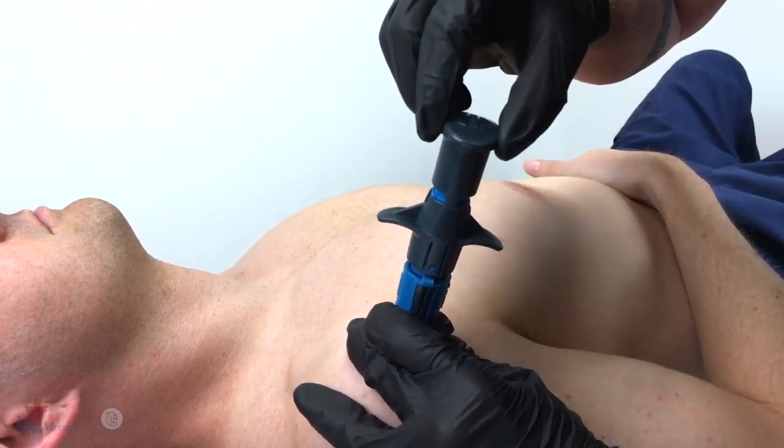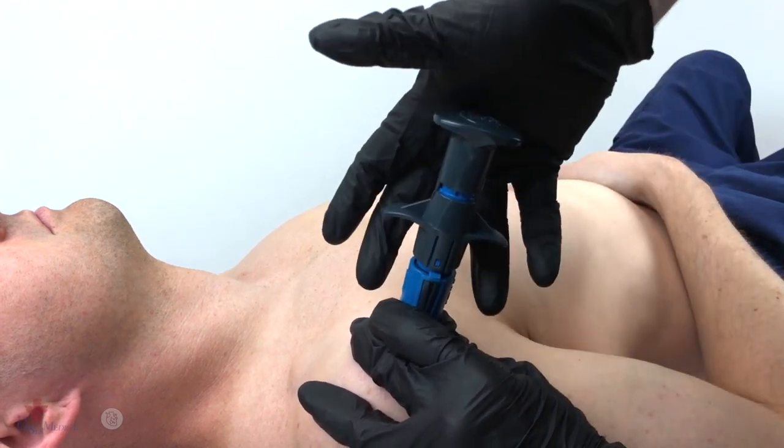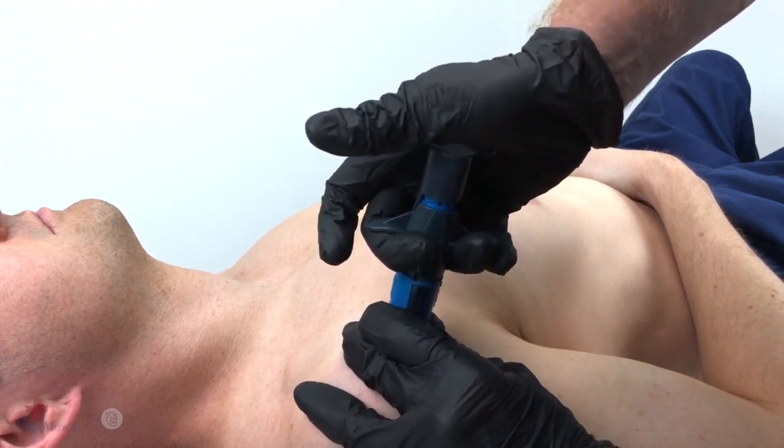Now rotate the safety cap 90 degrees, utilizing the palm of that hand, fully compress the neo, then pull up on the trigger wings, deploying the neo.